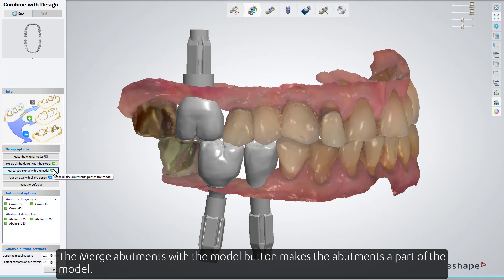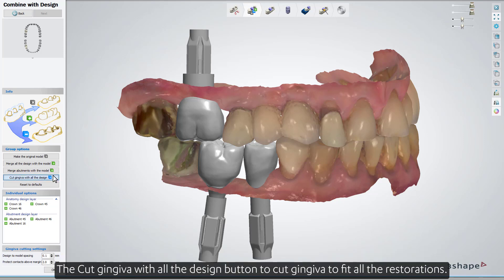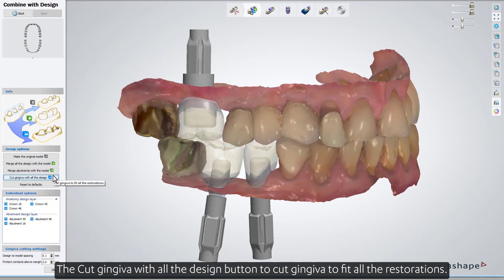Anatomy items can be effectively used for merging with the model or cutting gingiva to have space for further manual anatomy creation. The 'Merge Abutments with the Model' button makes the abutments a part of the model. The 'Cut Gingiva with All the Design' button cuts the gingiva to fit all the restorations.